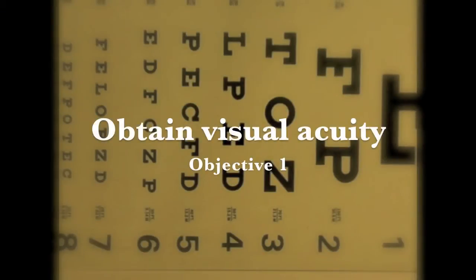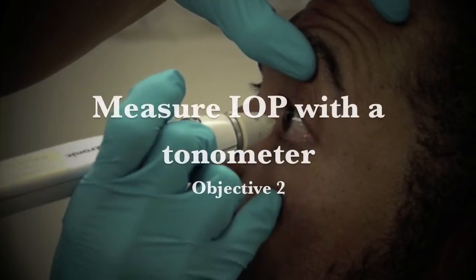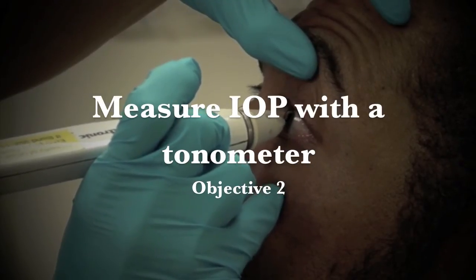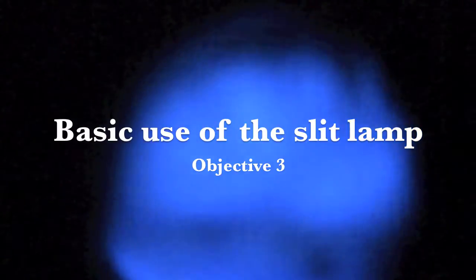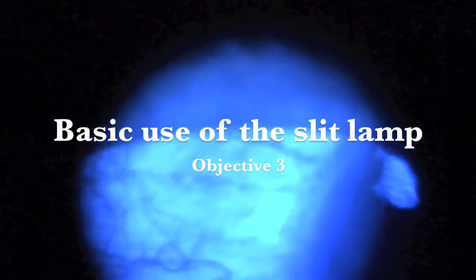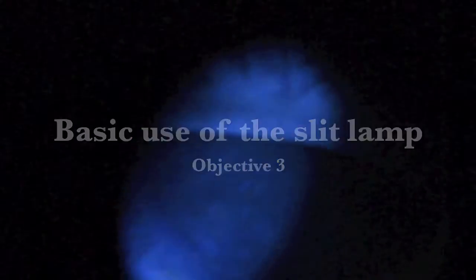After this instructional video, you should be able to: one, obtain a visual acuity measurement with a Snellen chart; two, calibrate and use a portable electronic tonometer to measure intraocular pressure; and three, use the slit lamp's basic functions in order to focus on eye structures, including the cornea with fluorescein staining.